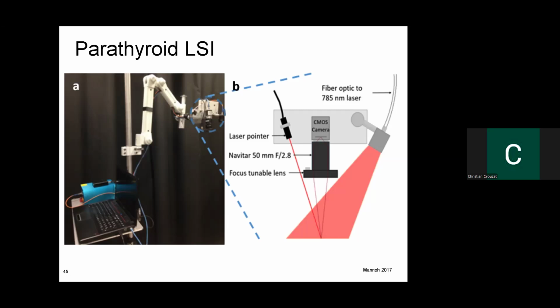So the question is, how many images do you typically use for the temporal imaging? And the answer, it varies a lot. So sometimes, you can get away with, say, 10 images if you want to look at just a small area in time. Sometimes, you want to use a second's worth of data to get a really high resolution image. Some of that you will be covering in the lab later today. And then there's other times when you just want to use a single image, and we'll get into that a little bit later, of what you can utilize with just a single image and looking at that very quickly over time.